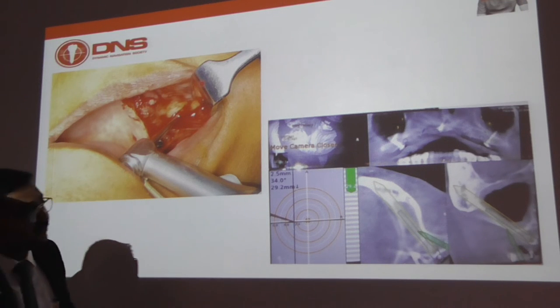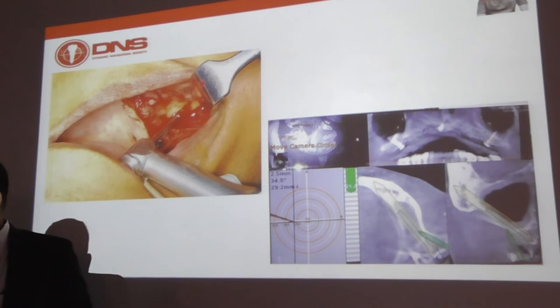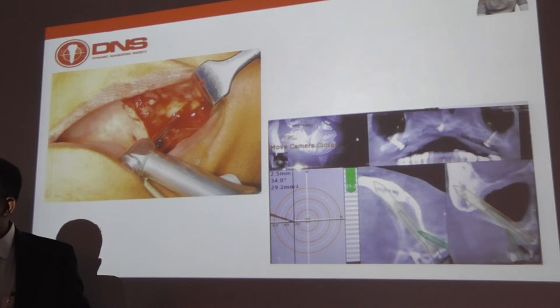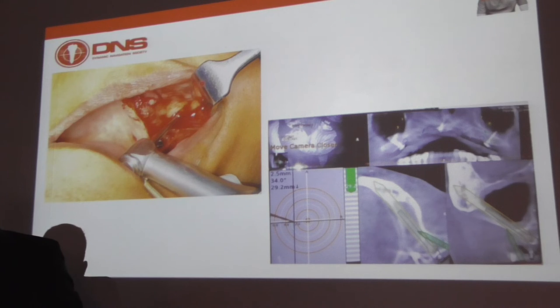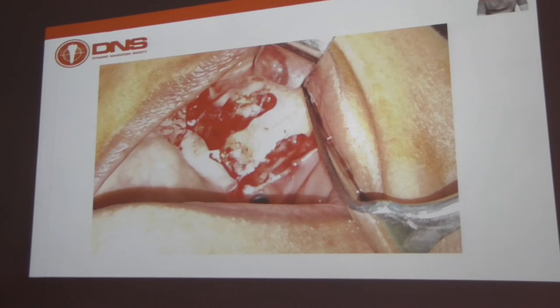Because now if I have three points here, 1, 2, and 3, when I put my next drill, I will put it along those three lines, so I know which position I am in, and I just have to correct from buccal to palatal. My mesiodistal angle has already been decided by these three points. Only the buccolingual direction is what I will have to judge when I'm drilling. So then I would use the round burr and the lateral cutting diamond points to create these grooves.